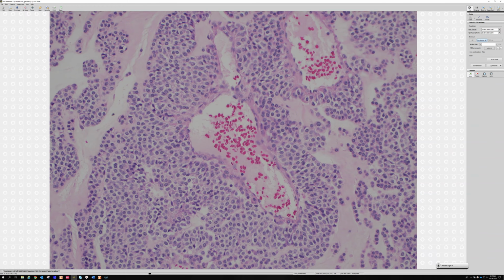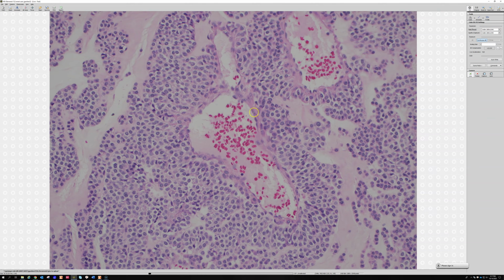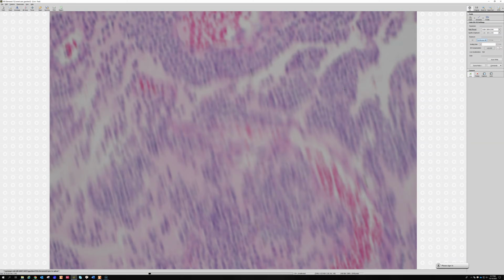So these look vascularized, but they're not truly vascular neoplasms, right? They're not neoplasms of endothelial cells. When you look closer, you can see that these are endothelial cells in here, but the tumor cells are separate, out around the outside of the vessels. So that can be a helpful trick when you see a very hypervascular tumor with lots of vessels, and you wonder, is it angiosarcoma or hemangioendothelioma, something like that. When you look close and see the endothelial cells are definitely distinct and separate from the neoplastic cells, that can help you sort out that it's not really a vascular neoplasm. It's a neoplasm that has a lot of vessels in it. And I've seen practicing pathologists really struggle with that and get it wrong, and it can make a big difference.